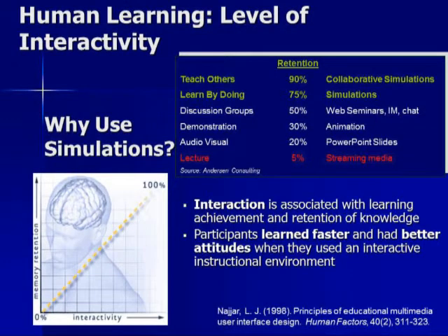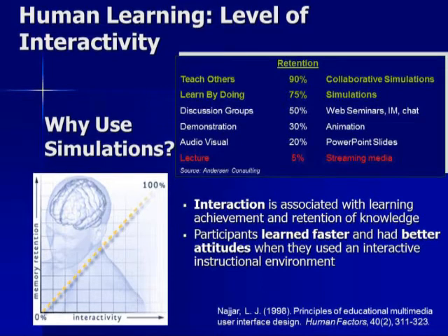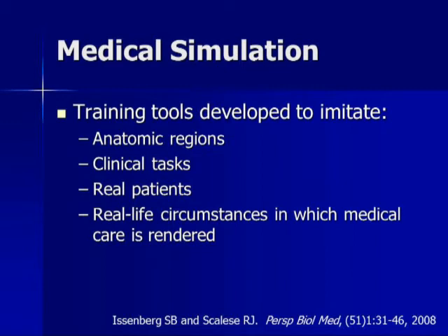I think most of you have seen these slides, but this really looks at why simulations may be helpful. The interaction of participating in a simulation really is the key to gaining some benefit from education. And people who've participated in simulation have been documented in multiple venues to learn faster and have better attitudes about their education. I think it's a more engaging approach, and particularly for us being very visual folks, looking at X-ray monitors, hemodynamic monitors, simulation actually is a lot more similar to our environment than perhaps for many other environments.